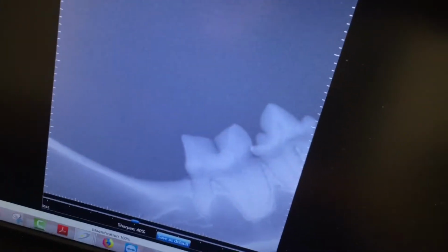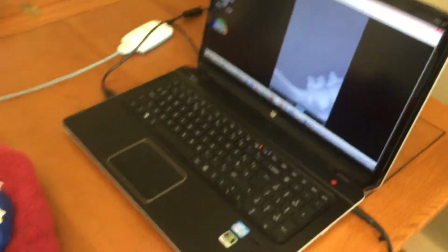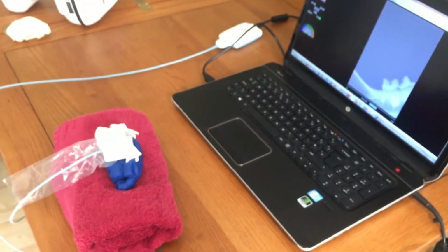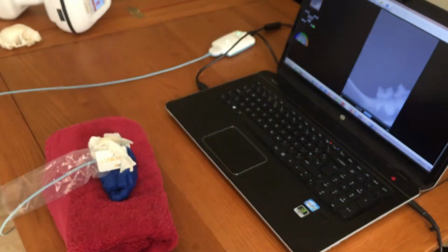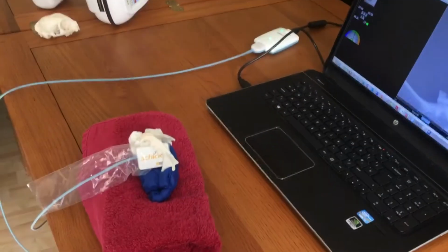So two different ways of doing it there. You either use a bisecting angle technique and leave the sensor pointing up to the ceiling, or you put it in as you see here and you're firing straight on at it. Okay, hope that helps.